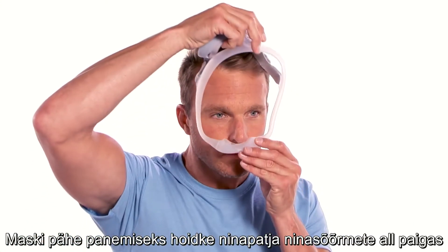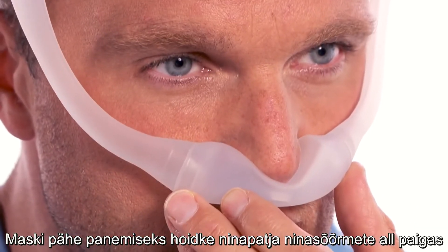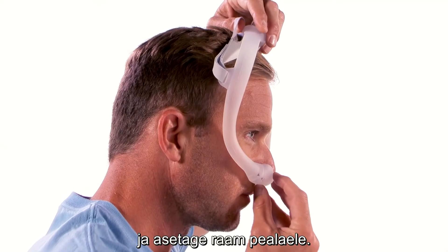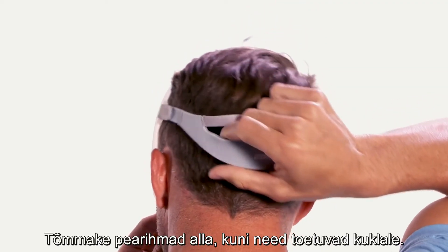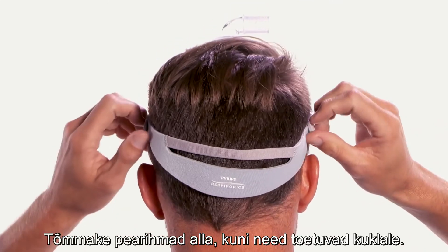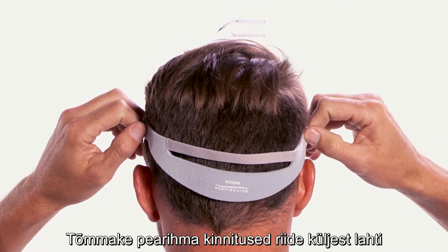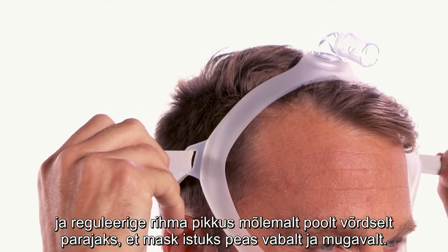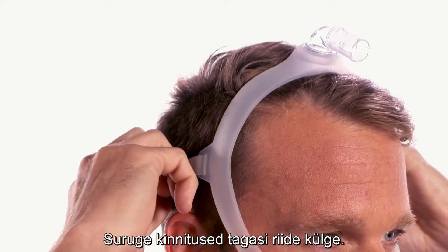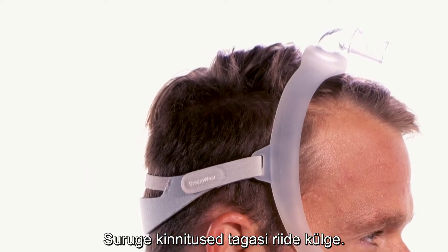To put the mask on, hold the cushion in place beneath your nostrils and position the frame on the top of your head. Pull the headgear down until it sits across the back of your head. Peel the headgear tabs away from the fabric and adjust the length of the straps evenly to achieve a loose, comfortable fit. Press the tabs back against the fabric to reattach.